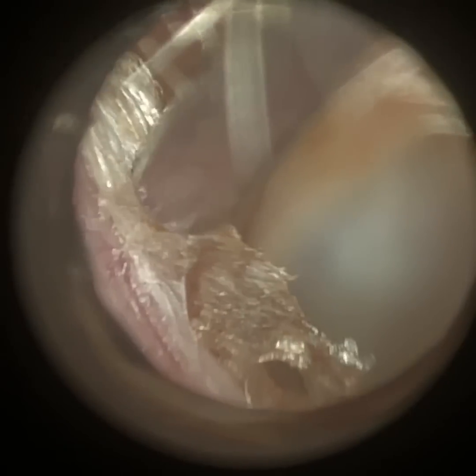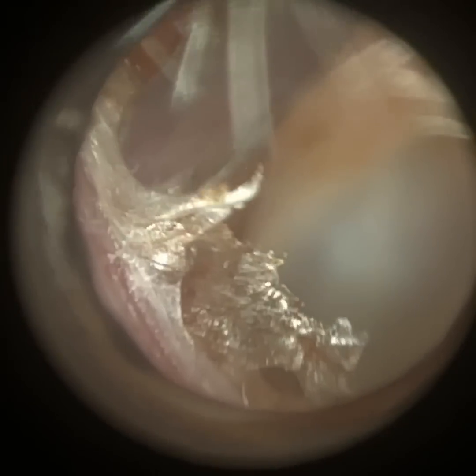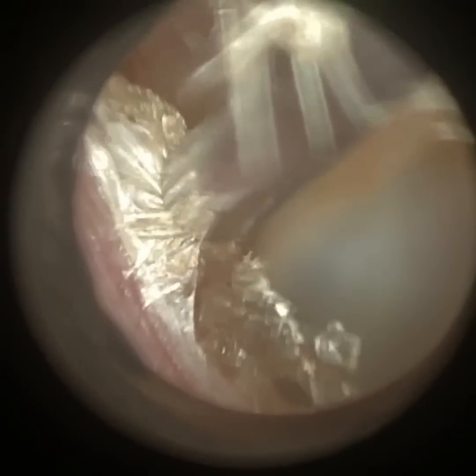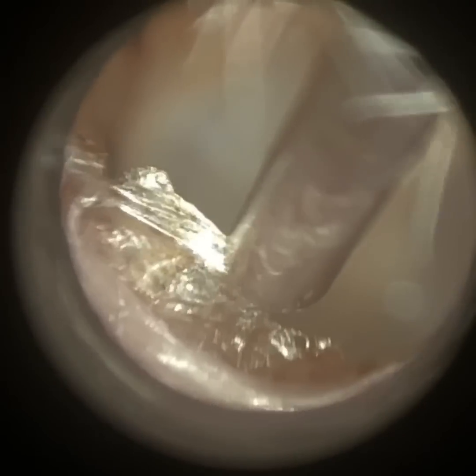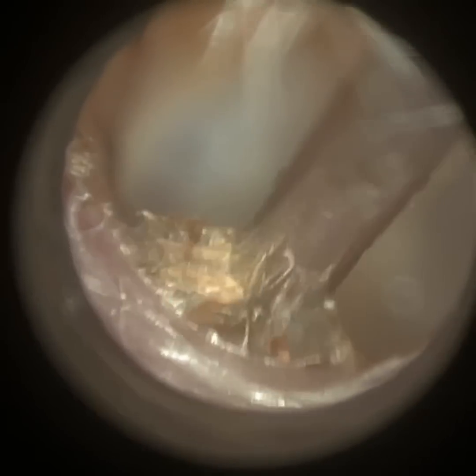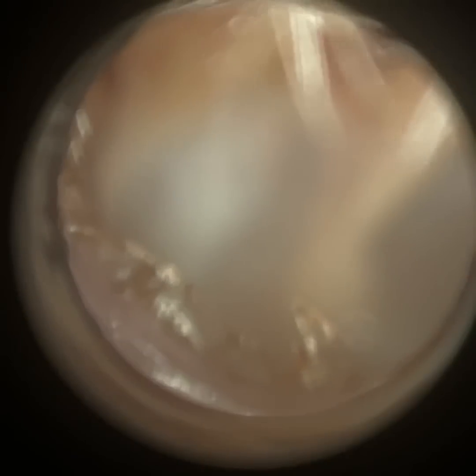I'm going to just peel that away. You can see it's really adhesive, but I think we do manage to peel this. I'm just going to peel downwards, and we're going to go towards the eardrum in a moment. And the fine end's really good at this because it reduces clarinetting, which is this high frequency squeal caused by the skin being suctioned, and you just get a bit more precision.